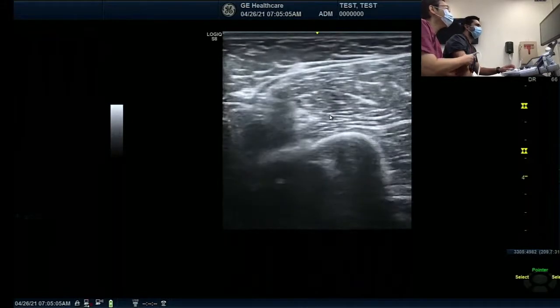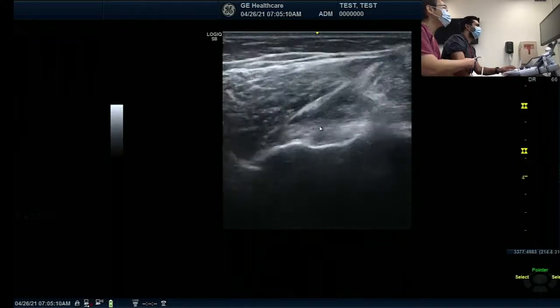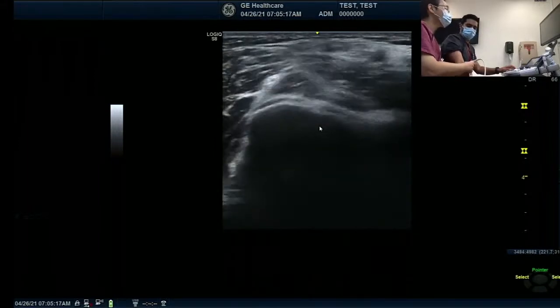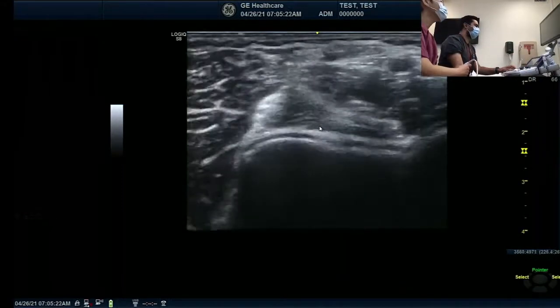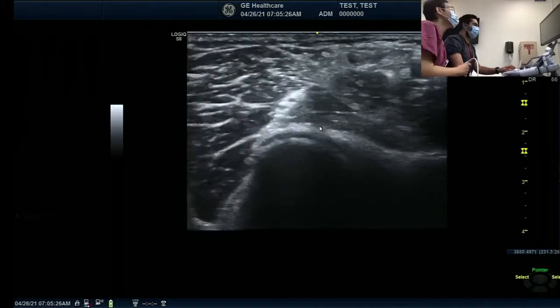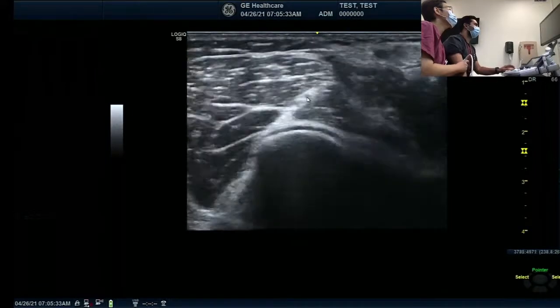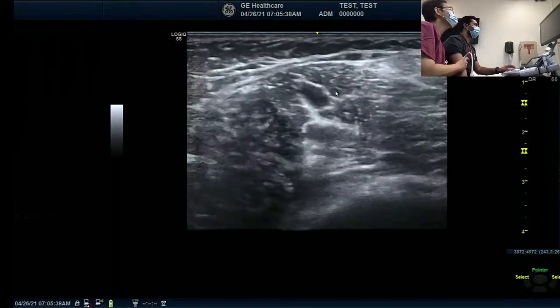That's good. So now I'm one-fifth above the elbow, and then I'm going down. I'm in the elbow joint, which is our home base. So you can see now we can change the depth, right? Divas is a very healthy man. So let's take a look at the proximal one, the superficial one. The superficial branch, if I go up, is very hard. I've never done it. So here we go.